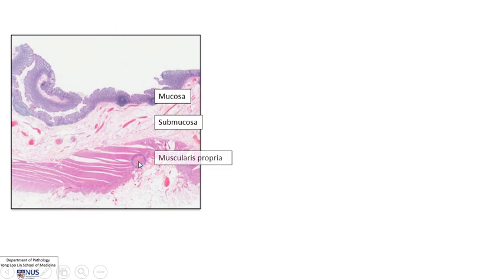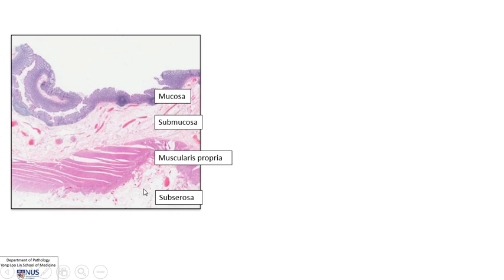Then we have this pink layer here, which is made up of smooth muscle called the muscularis propria. Within this, there will also be the nerve bundles and ganglion cells that drive peristalsis. And finally, just below that is the subserosa, which is usually composed of adipose tissue. The serosal surface, if the part of the gut is not retroperitoneal, will have a lining serosal surface covered by mesothelial cells.